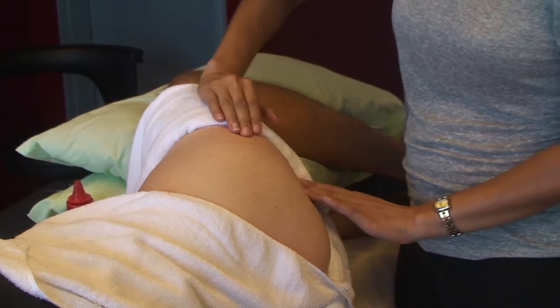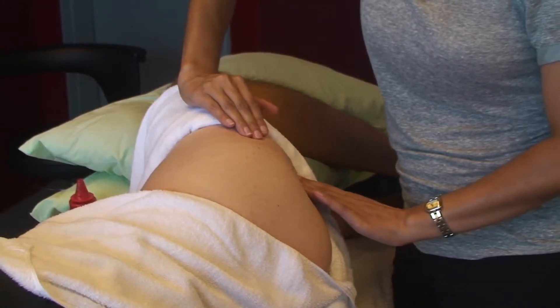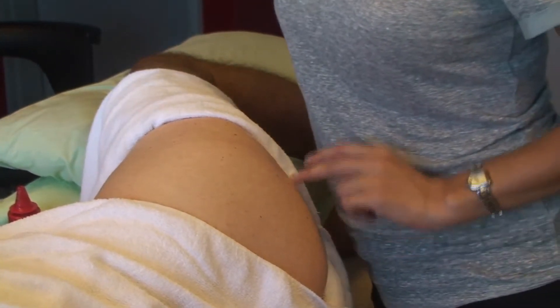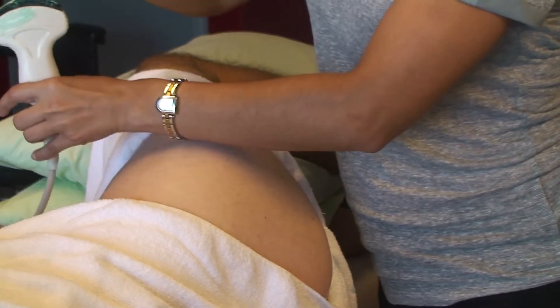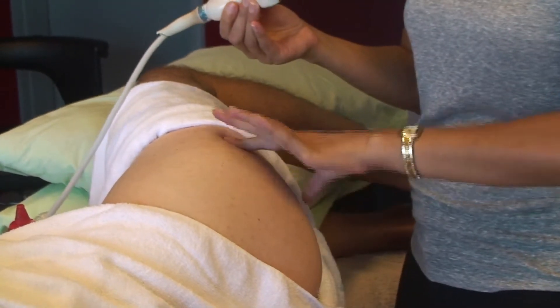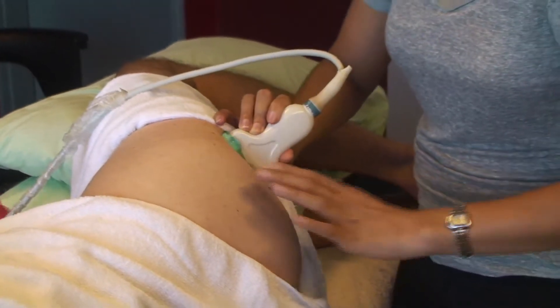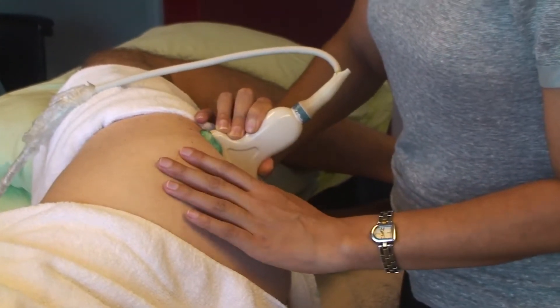What we actually want to do is create a type of shortening — it's like closing a matchbox in that direction. I'll take the transducer head, apply lots of gel, find the greater trochanter, the ischial tuberosity, and go straight on. Then we'll go to look at the machine.